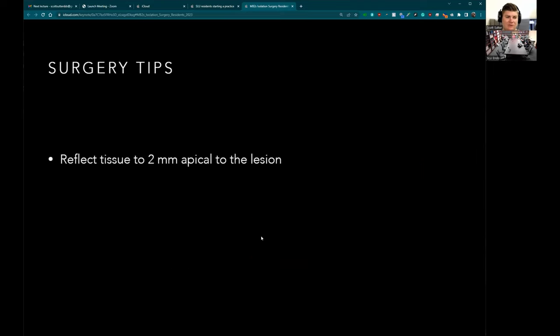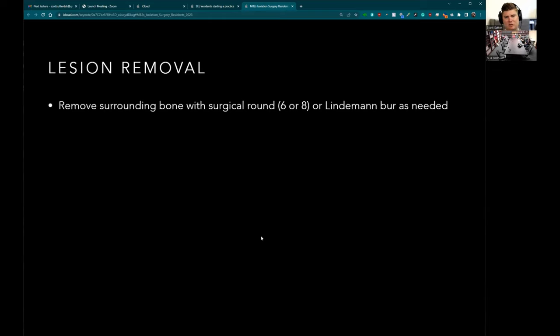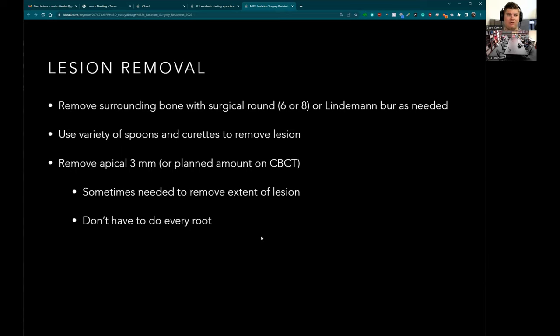Go about two millimeters apical to the lesion, place your Minnesota there and it just stays until you're done. Do not push the Minnesota into the flap — it causes bruising and hemorrhage. Make sure assistants are not pushing it hard into the flap either. To remove the lesion you generally need to remove a little bit of bone — use either a round bur or the Lindemann bur. Remove about the apical three millimeters, but plan this out on the cone beam because sometimes you need more or less. Sometimes you have to do the apicoectomy before you can even get the rest of the lesion out.